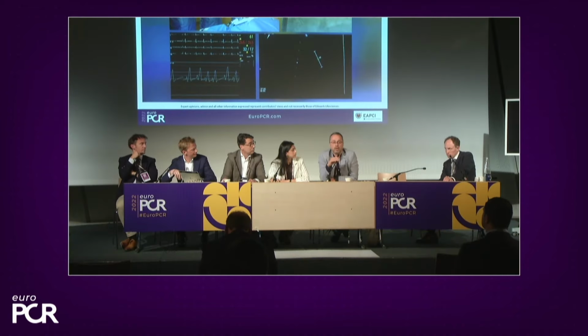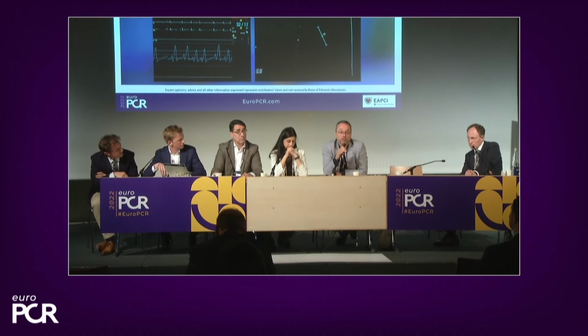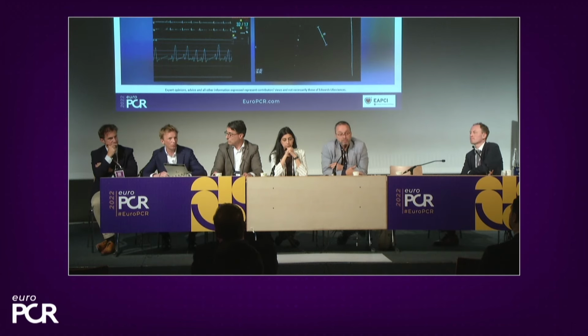Usually in these high-risk patients, we're looking beyond in-hospital outcomes, the 30-day outcomes for severe events, mortality or something like that, is somewhere in the range of 1 to 2% in very high-risk patients. It's worth mentioning that the patient that I presented was in cardiogenic shock on inotropes. It's still a safe and predictable procedure and very, very hemodynamically benign. And if you look at the commercial data that you presented a second ago, the risk of mortality or conversion to surgery during the procedure is 1 in 1,000, which is a very, very low risk that we can tell our patients.